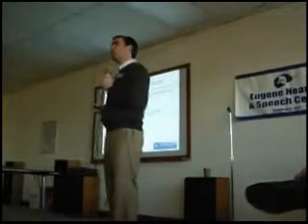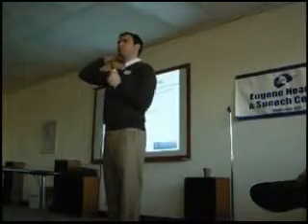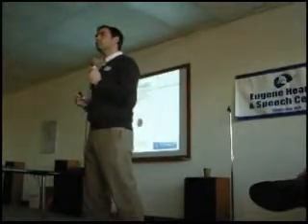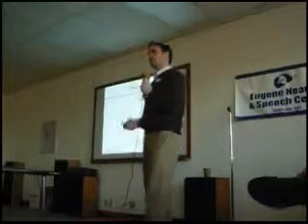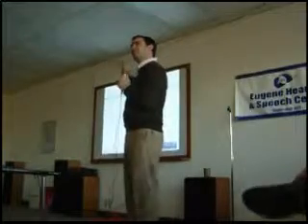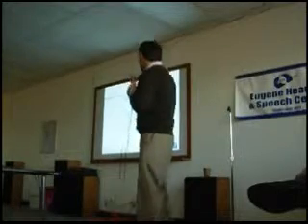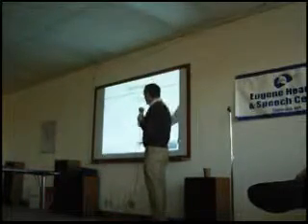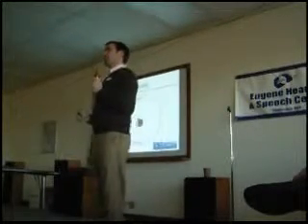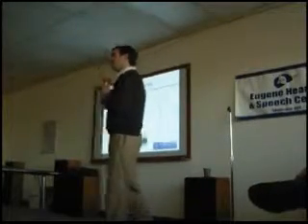A directional microphone is one that picks up sounds louder from in front of you and reduces the sounds behind you. Where is that helpful? If a person is sitting in a room, and you have to think about this great art, this is the head from above with the nose sticking out. You're looking at someone in front of you that you want to talk to. A hearing aid that's not directional is going to pick up the sounds in front of you just as loud as the sounds behind you. If it's a quiet room, that's fine. If it's a noisy room, where there's some noise going on, it's not so good.